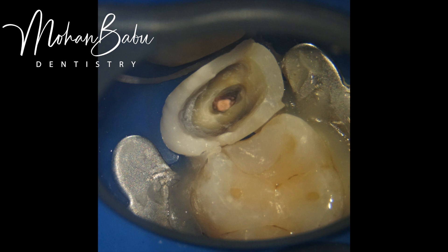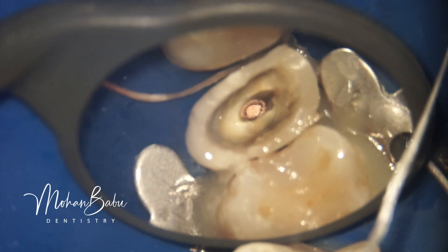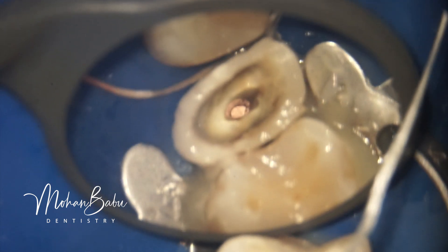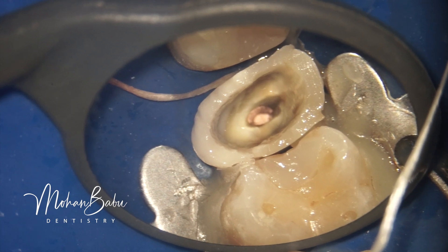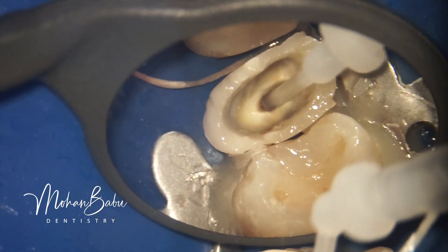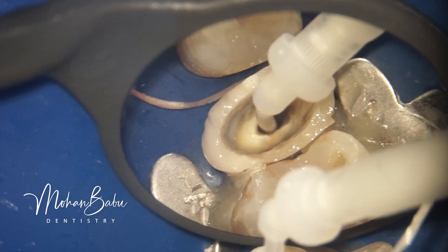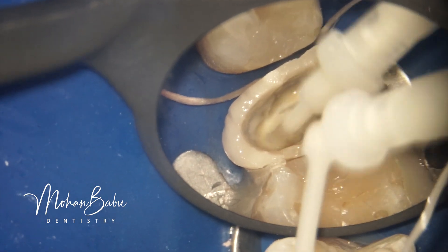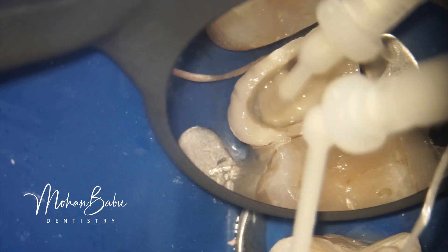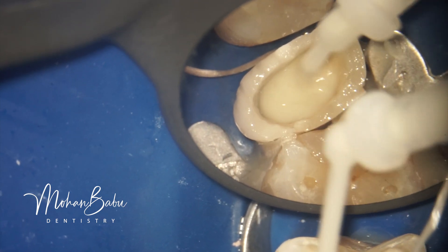The rim of GIC now acts like a matrix, with a complete seal that never allows any fluid seepage inside. All the GIC that was bonded on the tooth has been removed, so all the tooth surface is now available for bonding with composite material for the restoration along with the post and core. After achieving proper isolation, we proceed.